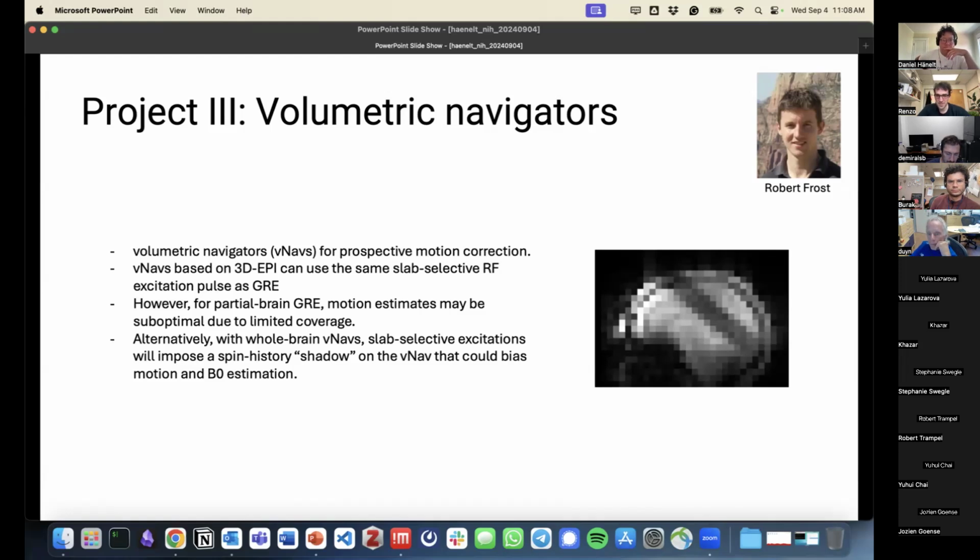And Jeff, you're using this for SLAB protocols too, right? Not only non-selective protocols. So the retrospective, yes, it's still SLAB. Okay, so you're not adjusting the gradients though. No, no. Cool. And this is similar resolutions, right? 0.35 or something, yeah. Similar resolution, great.